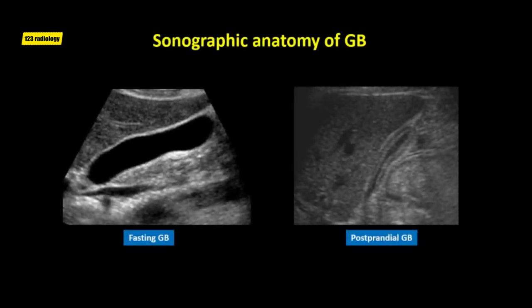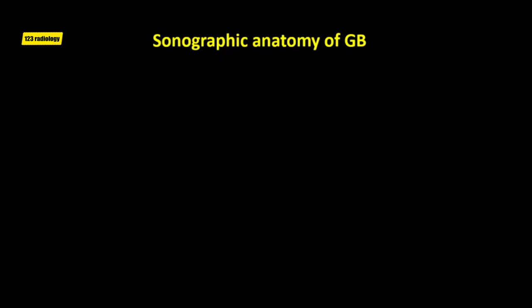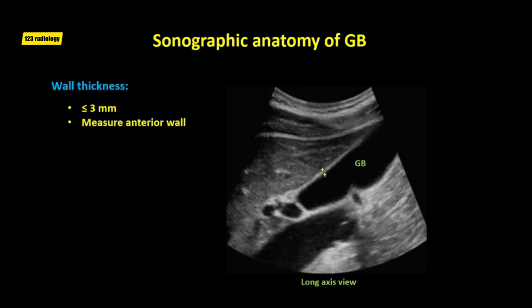Fasting of a minimum of six hours is required before evaluating the gallbladder, because a contracted gallbladder appears to have a thickened wall and can obscure intraluminal or wall abnormalities. The normal gallbladder wall is thin, smooth, and mildly echogenic, measuring one to three millimeters in thickness. When measuring the gallbladder wall, we look at the anterior wall in long-axis view with the ultrasound beam perpendicular to the wall. The normal gallbladder wall thickness should be equal to or less than three millimeters.